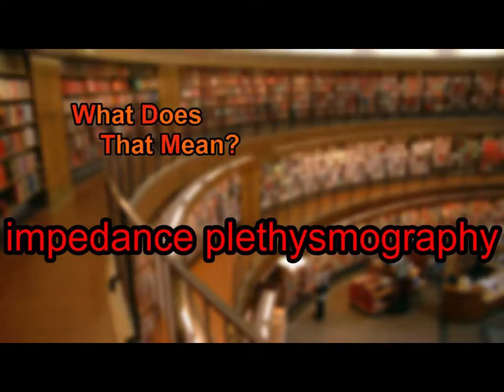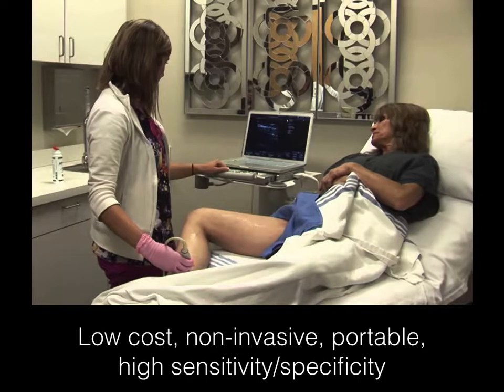Impedance plethysmography. Well, first of all, what in the world does that mean? And it's still really tough to nail this down. But basically, you're measuring the impedance across vessels and across limbs, and it is wonderful for academic centers and research, but really, we don't do it. So that means we're really left with ultrasound. Low cost, non-invasive, portable, and still really good sensitivities and specificities.